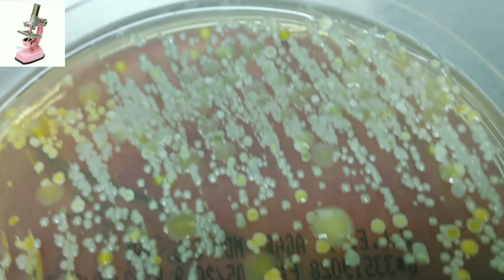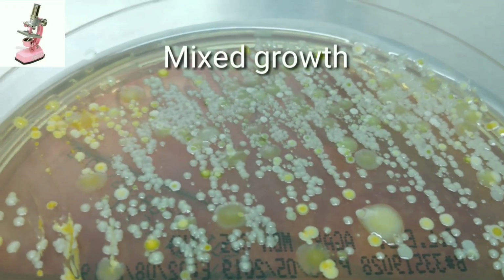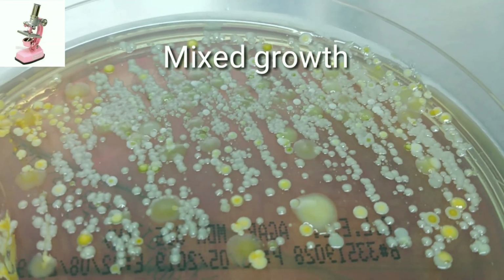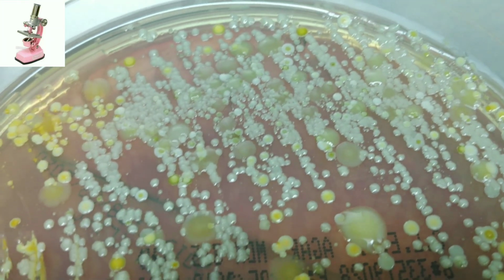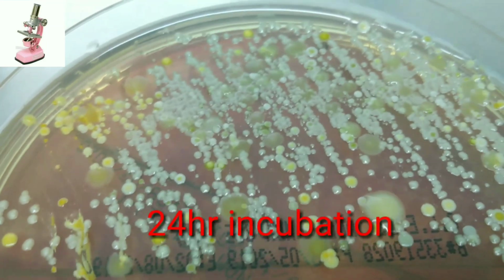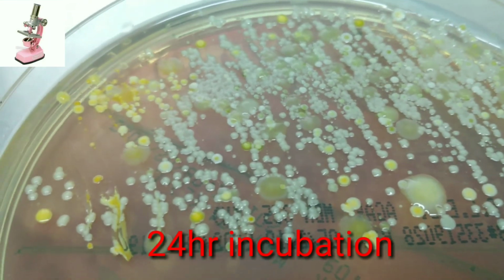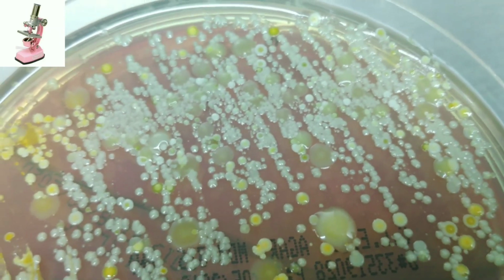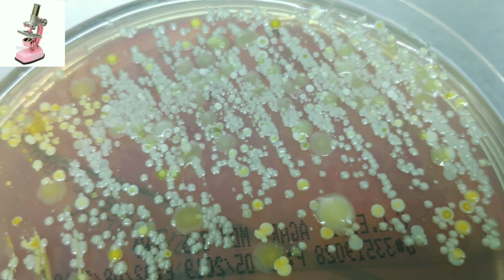So here I am showing you this media with isolated lots of mixed colonies. It's a mixed growth from urine sample. After 24 hours of incubation, we find lots of mixed colonies. So probably the sample is improperly collected and maybe already antibiotic is started.